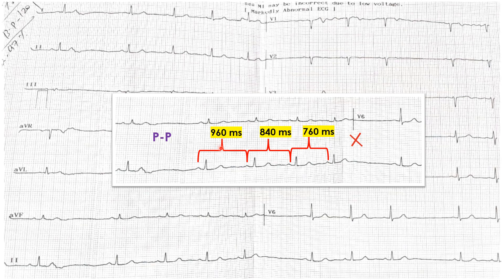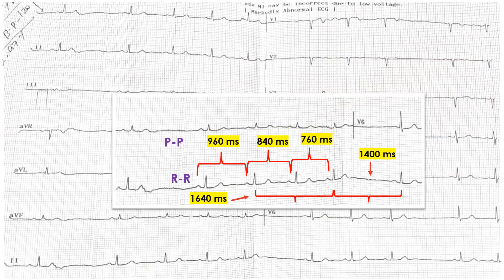This means the PP intervals are getting shorter. This is consistent with SA Wenckebach — which is opposite to AV Wenckebach seen on the ECG. In sinoatrial Wenckebach, one type of sinoatrial exit block, the PP interval gets progressively shorter, then there is a dropped beat followed by a pause, and then the P wave fires. The PP interval shortens in each successive beat until there is a dropped beat and the cycle resets.